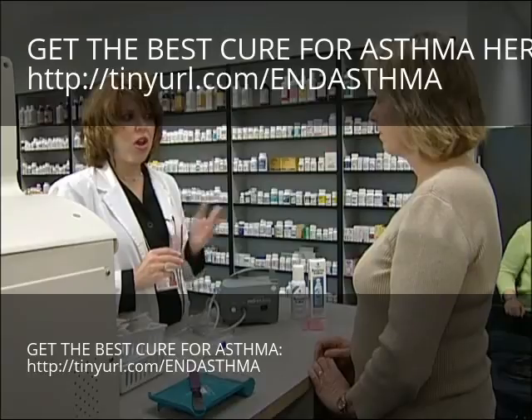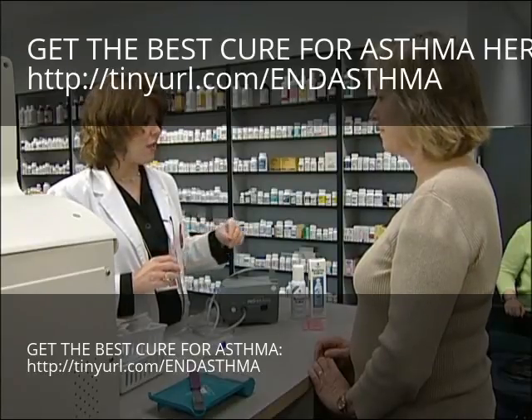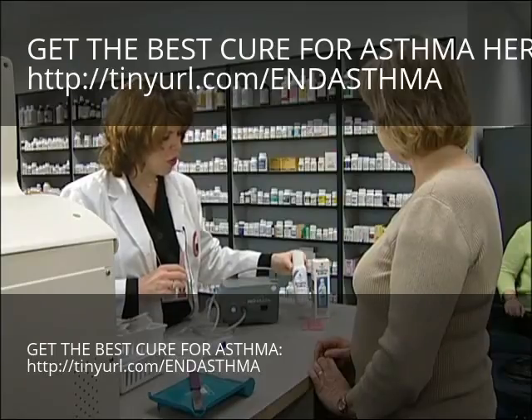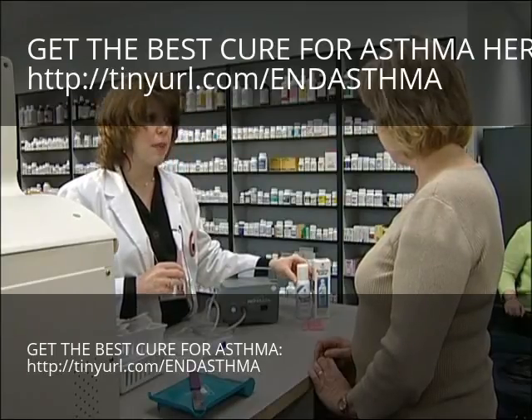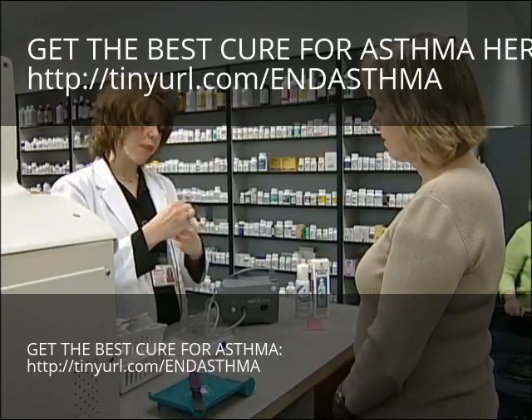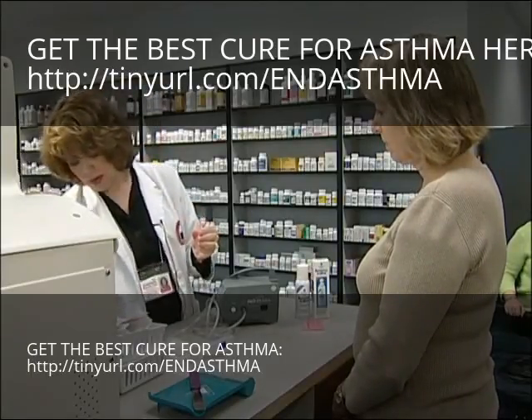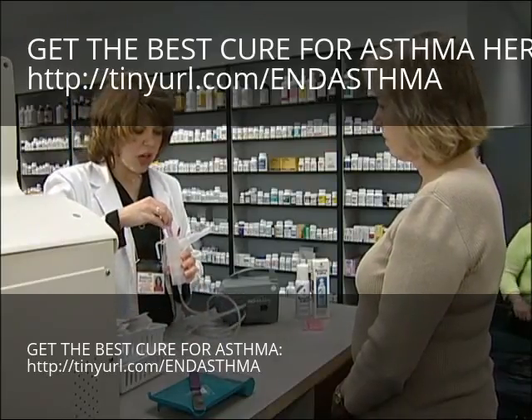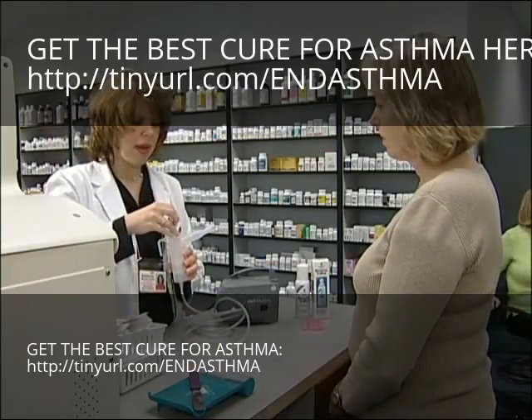However, there are other medications that require dilution. This is the saline that you would use to dilute your medications if you had a different type of prescription. Once you have your nebule, you just twist the top and open it. Then you squeeze the medication into the medication chamber.